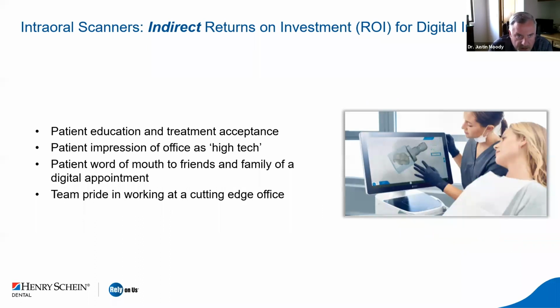Intraoral scanners often bring us an indirect return on investment as well. What I have seen from our clinics is it's an incredible patient education tool. During that new patient experience in our clinics, it's a real-time video of the patient's mouth, and you can see fillings, cracked fillings, and the shade of the teeth. You can put things together and show them bites, deep bites, open bites. You can show them cross bites. It's a great patient education tool.